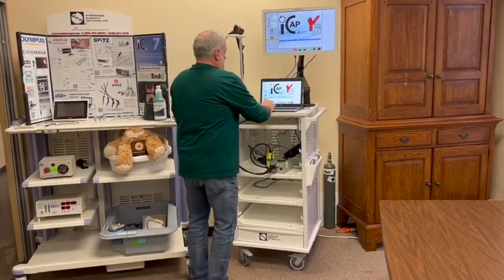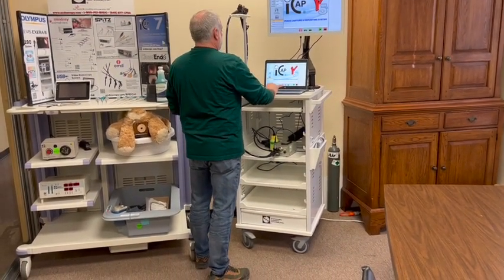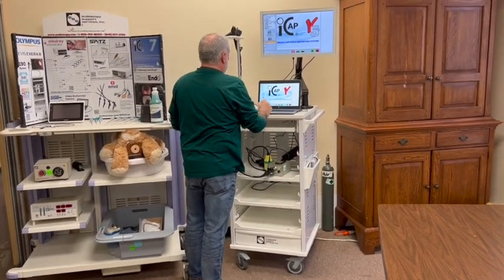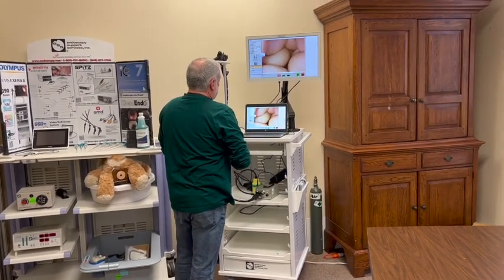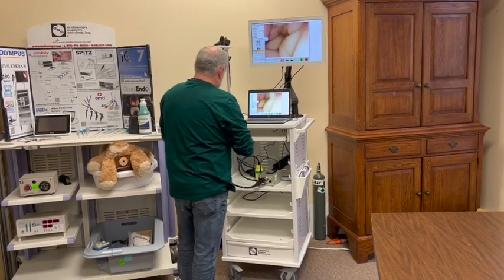We're going to go ahead, take the scope, connect to the live video by hitting 'Save and Start Procedure' here in our software. I've already filled out the patient information. Now I'm connected to the live video and I can see my image.